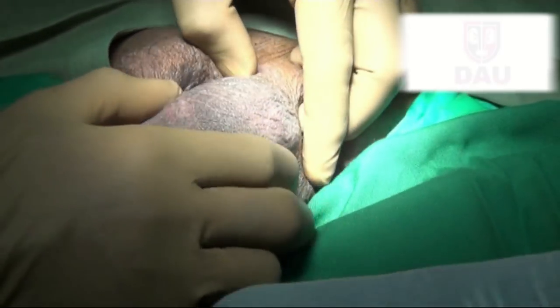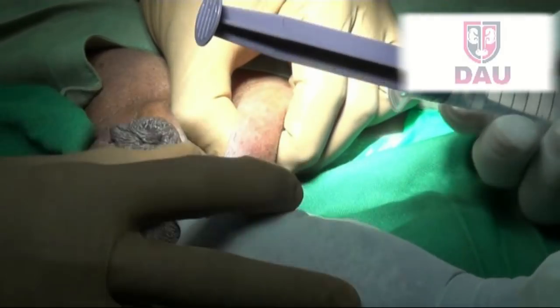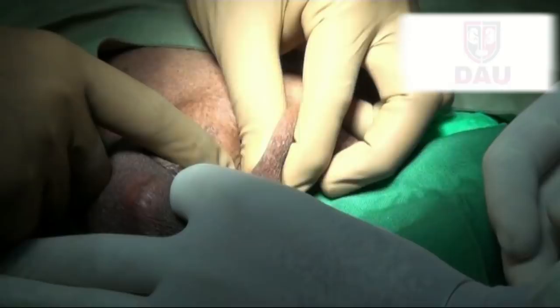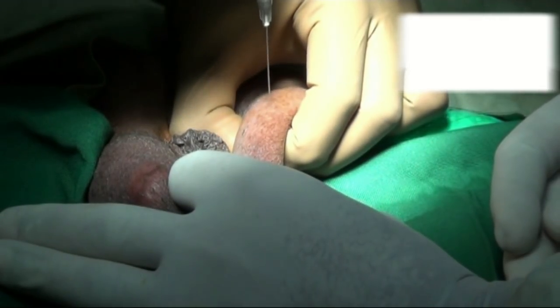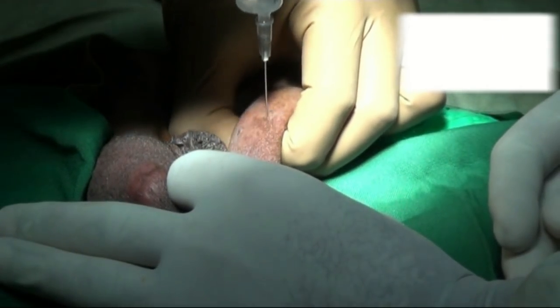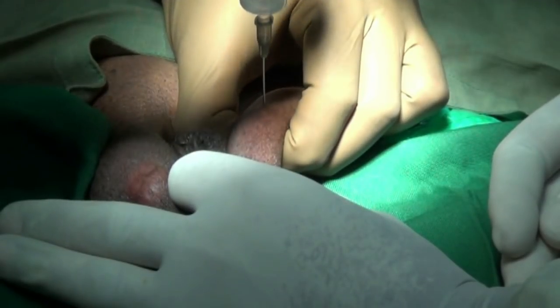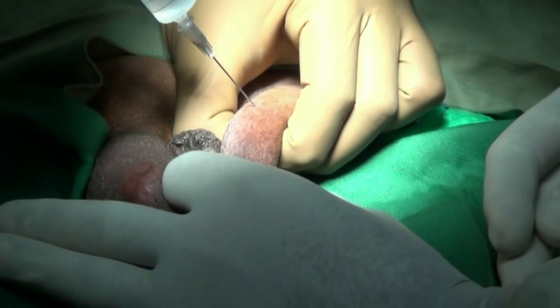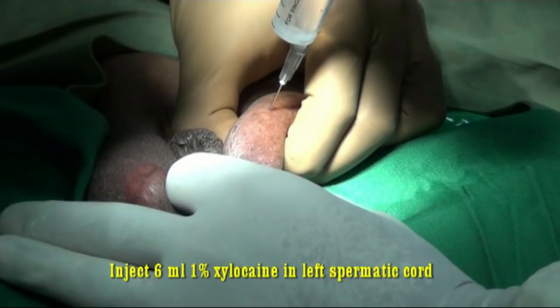We will now inject 6 ml lignocaine in the spermatic cord for a cord block on the left side. We will ask the assistant to pull the testes downward, and with the thumb and index finger I am behind the spermatic cord. I need to go behind the spermatic cord and then the first puncture is made vertically — aspirate, inject in the midline, then change the direction, aspirate, inject while you withdraw. Aspirate and inject.